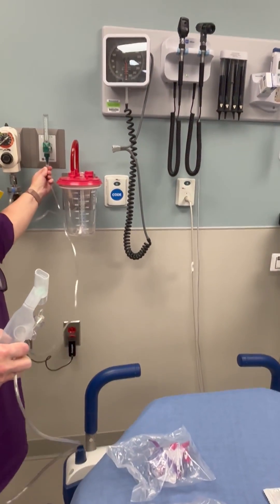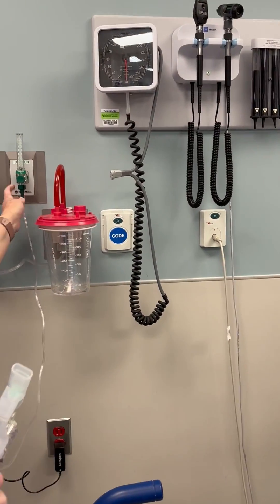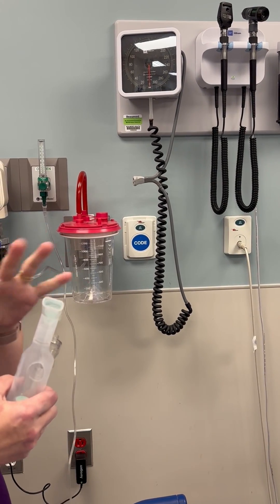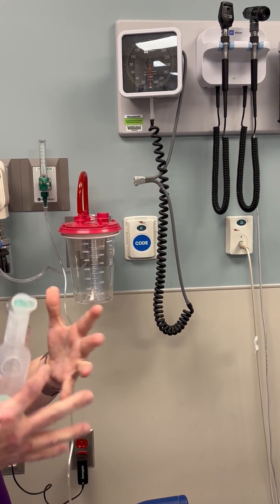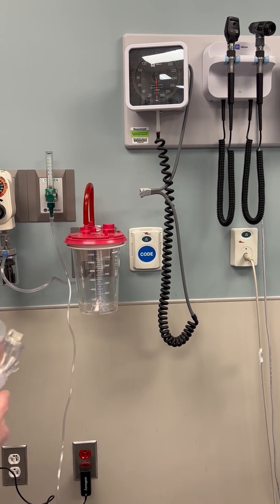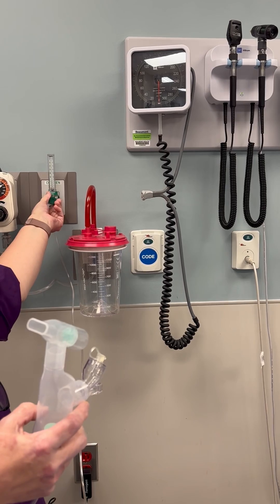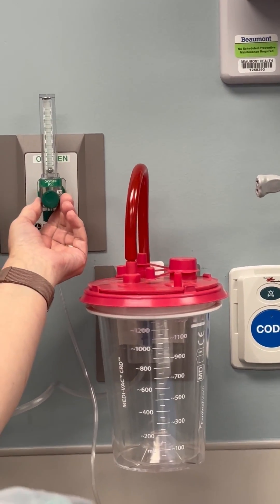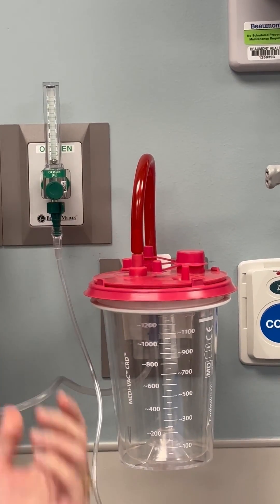Now when you're giving a treatment through the Aerogen, you never want to go above two liters because it's going to blow it all out and the patient is going to get little to no racemic epinephrine to help their condition. So I usually only have to run it between half and one — I never need to go more than that.